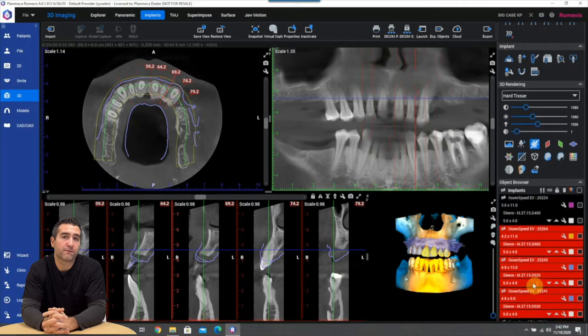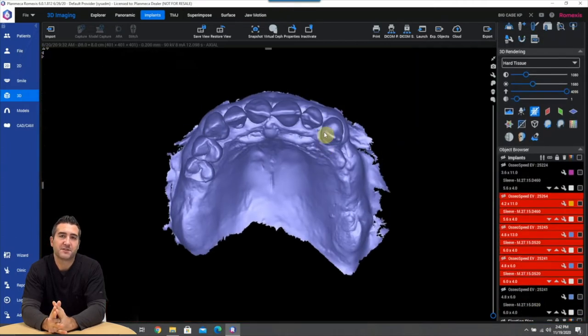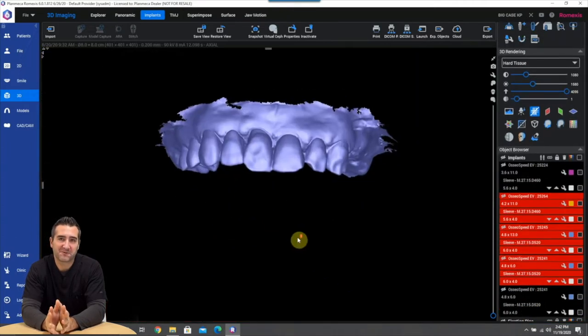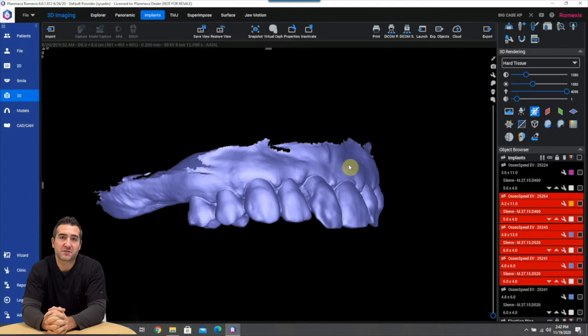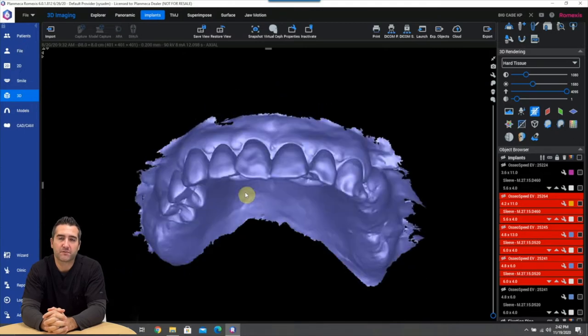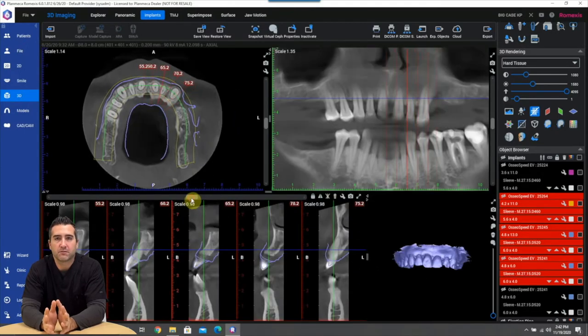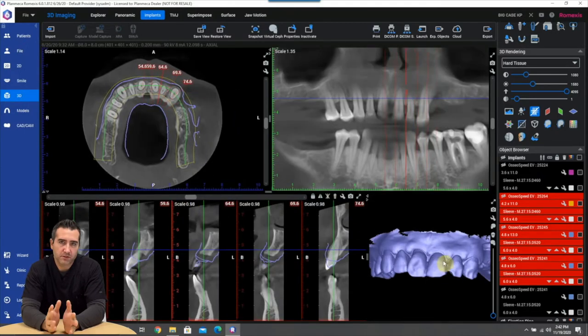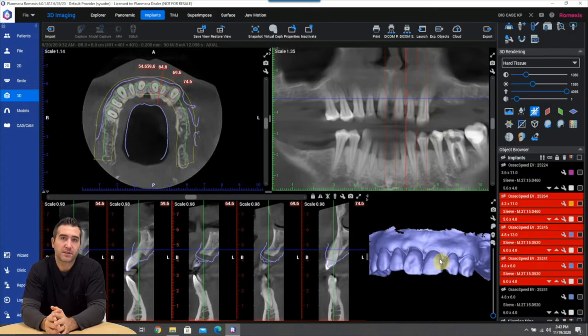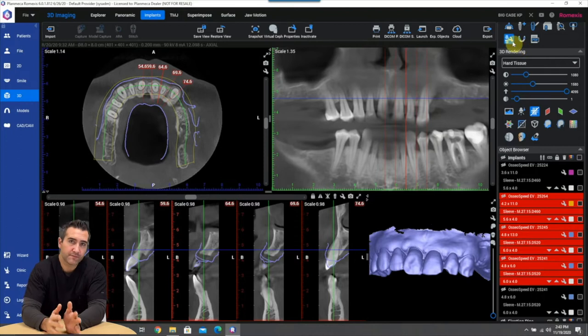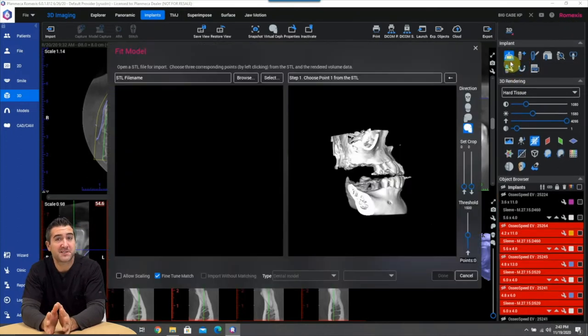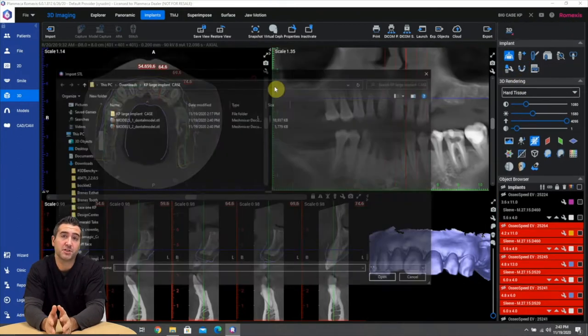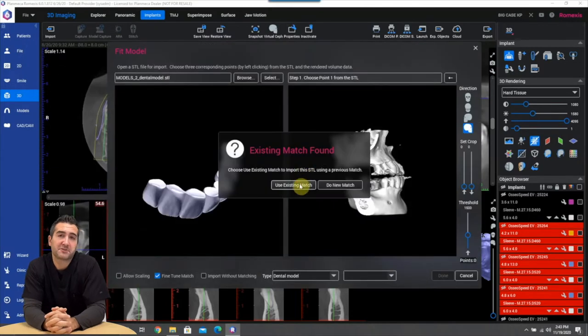It's really remarkable how these things fit together so nice from the algorithm in Romexis and you can also check on the cross-sectional view just to triple check and make sure that your intraoral scan is lining up perfectly with your DICOM data set because everything is going to be based off of this merge and if it's off you have to redo it.